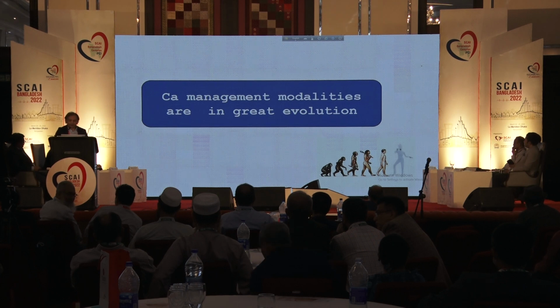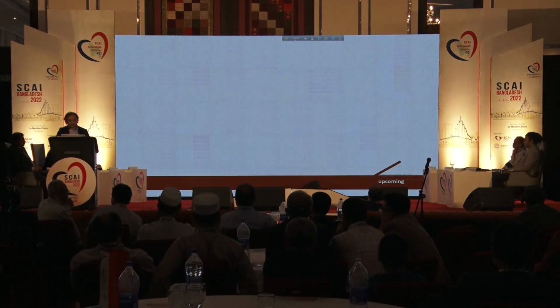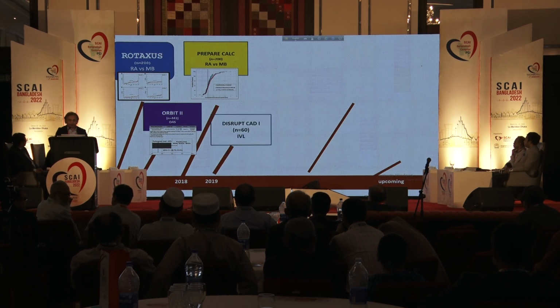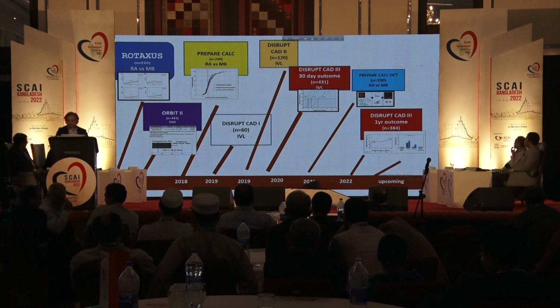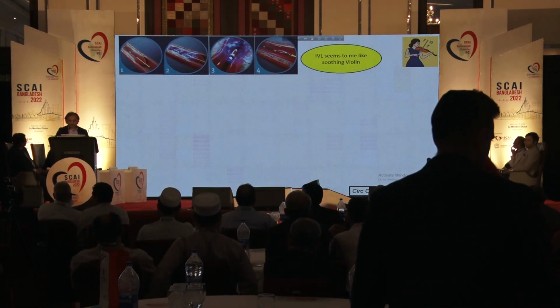So what I can say is that calcium management modalities are in great evolution, and lots of trials starting from 2013, the Rotaxus, ORBIT 2, Disrupt CAD, this is CAD 1, this is CAD 2, and then the CAD 3 30 days, and the CAD 3 recently the 1 year outcome. And these are telling that calcium is within our management philosophy.